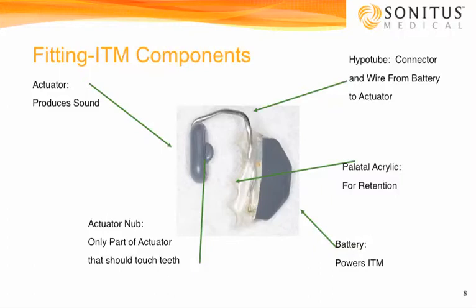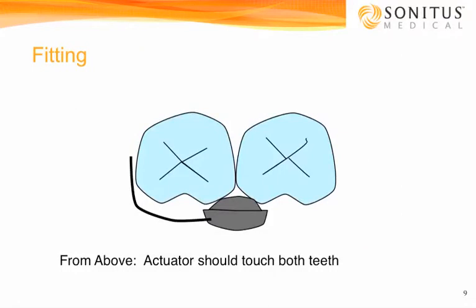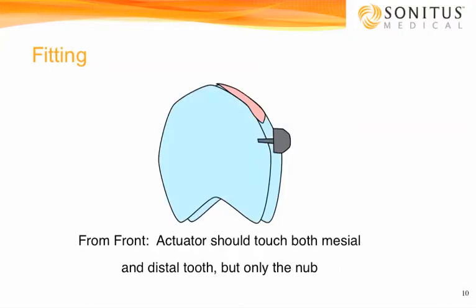That hypotube is a tube. It's not a wire. It has little tiny wires inside of it. Little electronics go through it, so be careful when you adjust that. From above, the actuator should fit, again, just basically touching two teeth, and fitting down below the height of contour of the most posterior two teeth. From the front, the actuator should touch both the mesial and distal tooth, but only on the nub. It should only hit on that little nub that we talked about earlier.